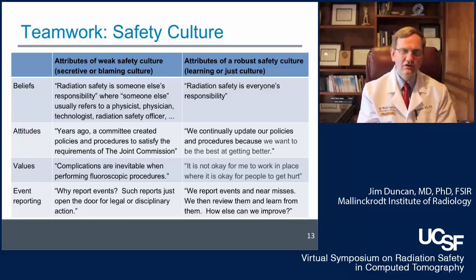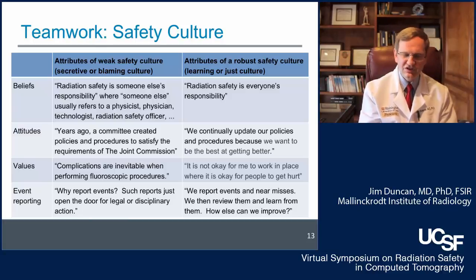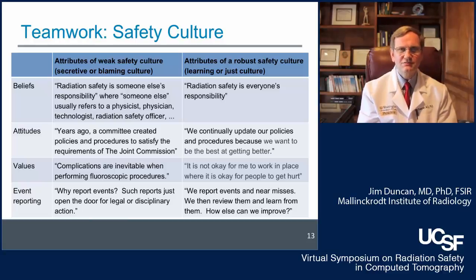The attitudes. If you have an attitude that, well, these protocols, we just did this for the Joint Commission, it was years ago, versus, we're watching this and we're constantly updating because we want to be getting better. The values. Complications. Well, complications, clearly, we're going to have a couple skin burns. Complications, it's just part of what we do. Well, it shouldn't be okay for all of us to work in a place where it's okay for people to be hurt. There needs to be a conscious and ongoing optimization of risks and benefits with every procedure.